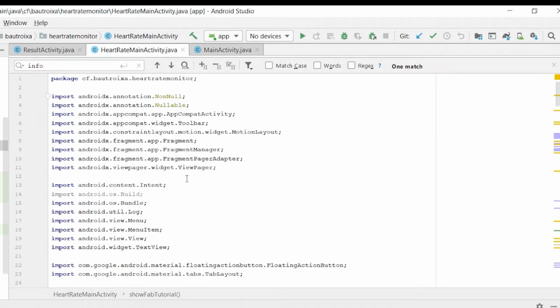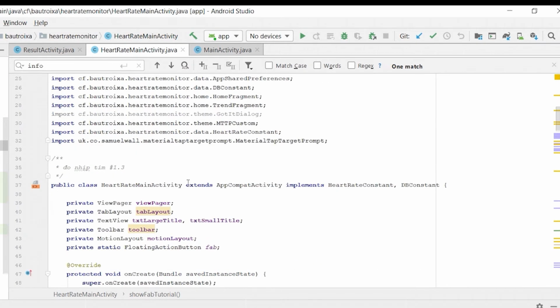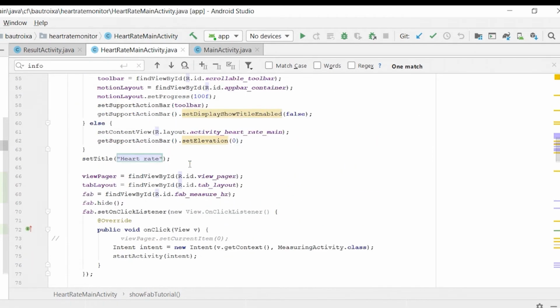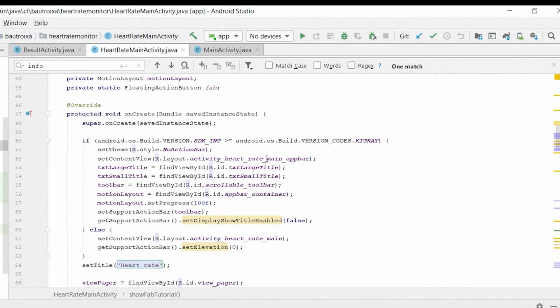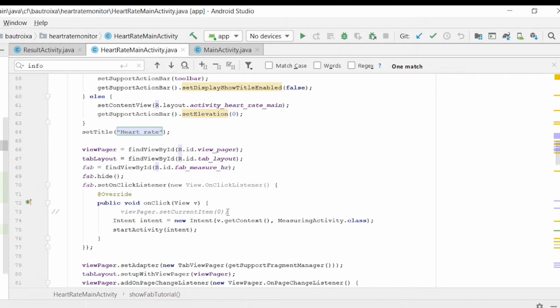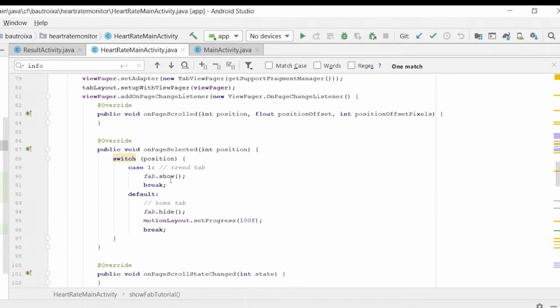In heart rate activity, we can see the packages that are imported for the current file. It includes the layout structure for the application, such as the view group, view menu, view text, and much more. Now, moving on, we can see the title is set to heart rate in our application, and the integers, view pager and tab layout are used to open the pages of the layout accordingly. The following consists of the home tab, so when it is selected, the trend tab will be hidden accordingly.